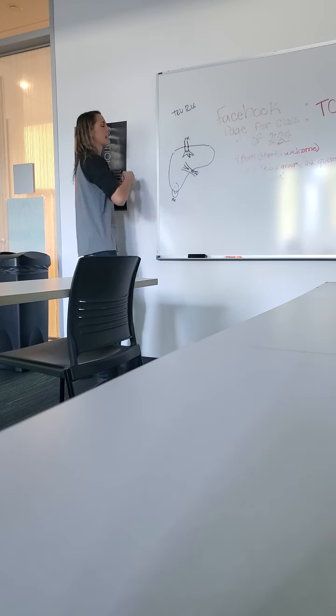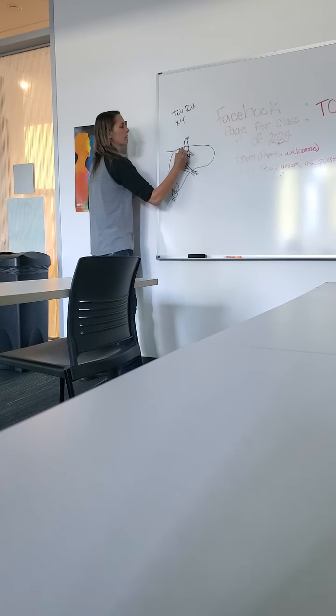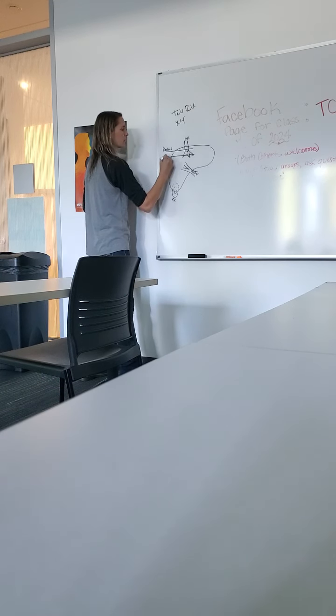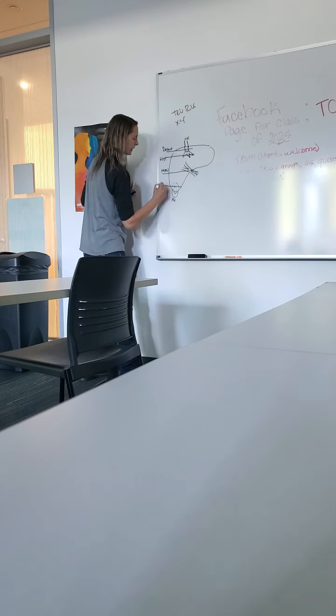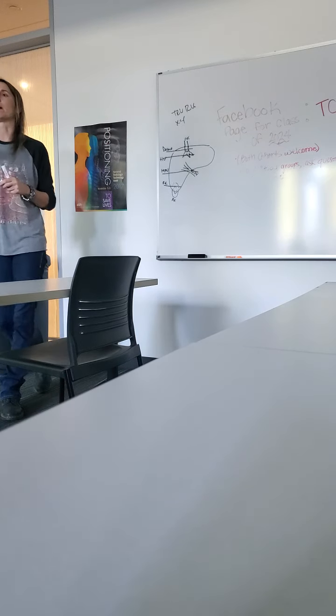Okay, so with this, we're gonna take 4 images. So we're gonna have one at the level of the dome, one at the level of the hepatics, one at the level of the MPV, and one at kidney land. So much easier in transverse, we have those landmarks.